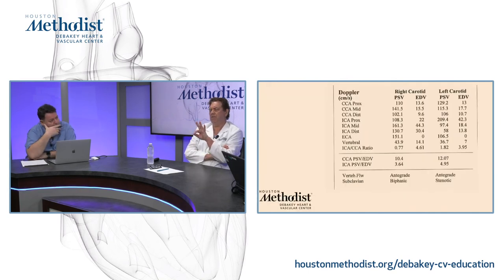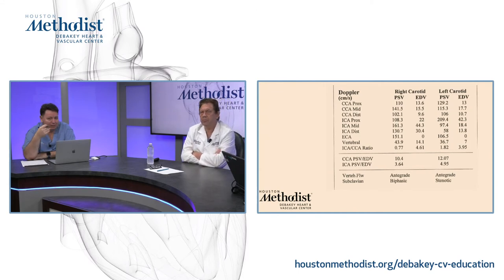If you have three different criteria and you only get one, that is pulling you down to the lower category. If you get two out of three, go up. Exactly. So I think that's just a practical way of utilizing that table. And this is, again, one more.